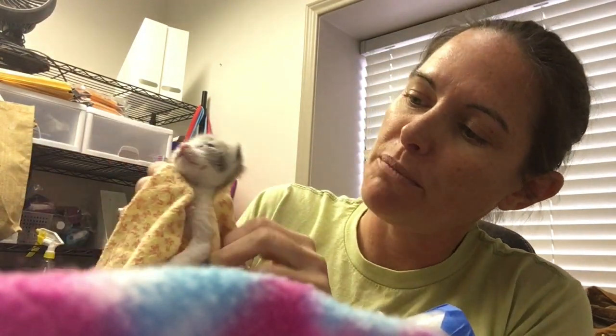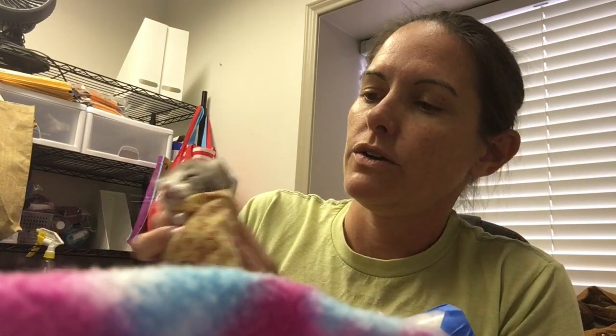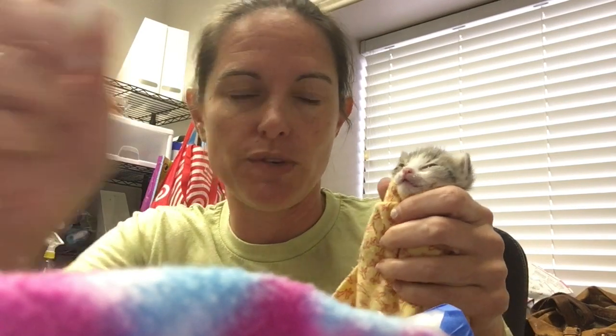So I'm going to wrap her so her little arms don't come out — just like a little straight jacket. And then you want to make sure your kitten does not have teeth. If your kittens do have teeth, you're going to have to wrap that bottom jaw or the tube will break. When they're biting down on it, they'll split the tube in half.